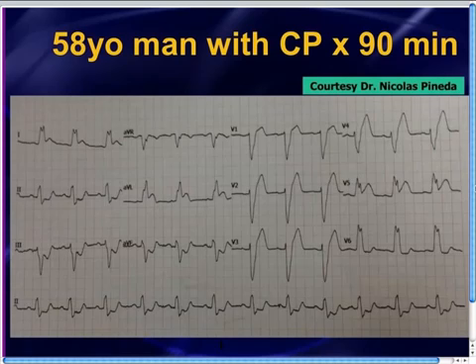Well, when somebody's got chest pain in the left bundle, we've all learned that you can't read any ischemia in the presence of a left bundle. Well, if you've been keeping up with the literature, unlike perhaps some of your consultants, no names to be mentioned, you know that you can actually, in many cases, read ischemia in the presence of a left bundle. Not always, but in some cases you can. So that's what we're going to spend time talking about.